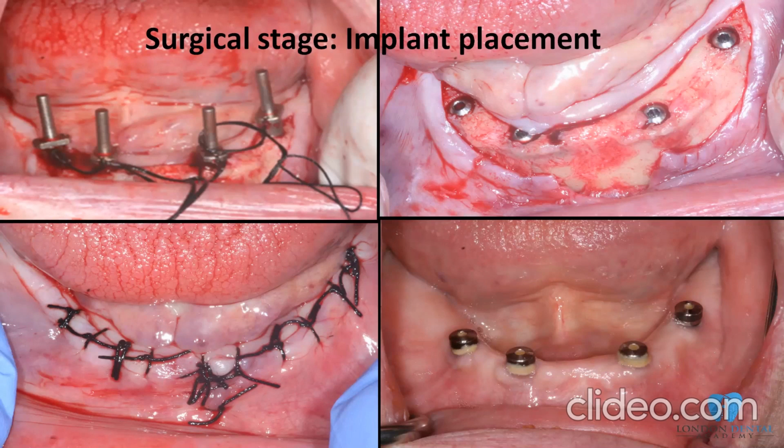You never know, with the CBCT not necessarily being accurate. You've got looping of the mental foramen, the ID nerve. I would love to visualize it. I'd like to see what's going on before placing, especially with the 6 implants, more complex cases, severe cases. This is a standard case, but we treated people in their 80s and 90s, so we know exactly what we're signing up for.